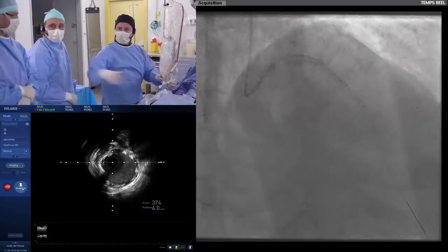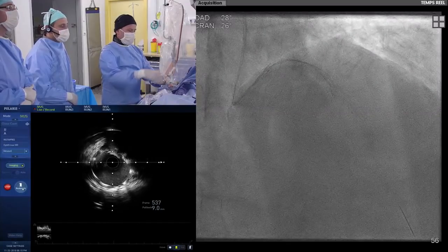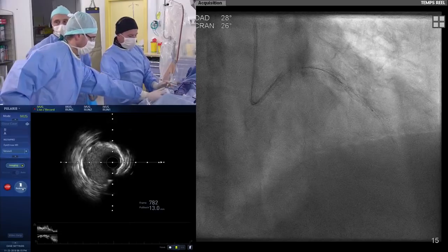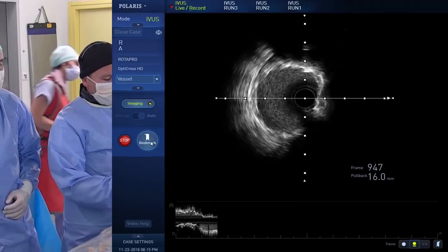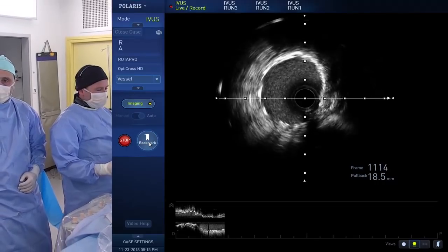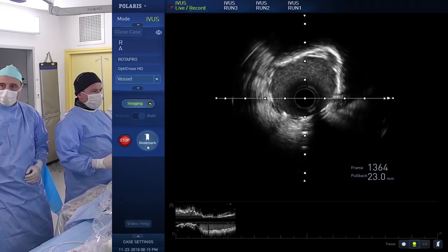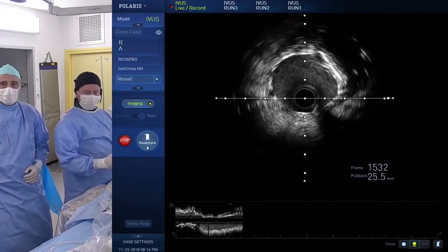We might think to do stent ablation as well. This has been performed, even though it's a kind of technique that I wouldn't recommend for colleagues who are starting to have experience in this. We have published a short series on stent ablation using rotablator. If you do this, you have to be sure that your stent is well apposed. Yeah, correct. And this is only a dog bone effect, and you have to manage only a malexpansion. But there is no malapposition, and thanks to that, you will only break the fibrosis and the underexpanded strut, not all the stent. Shall we have a look at this IVUS, Adam?